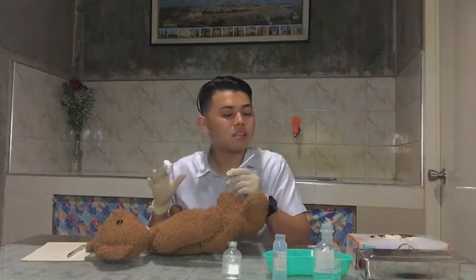Grasp the syringe with your dominant hand by holding it between your thumb and your fingers, with the palm facing into the side or upward for a 45 degree angle insertion, or with the palm downward for a 90 degree angle insertion. Prepare to inject by using the dominant hand. I'm left-handed. Grasping will create a firm hold.